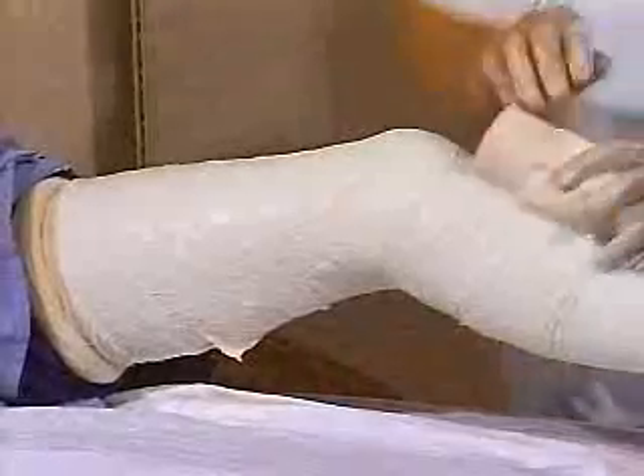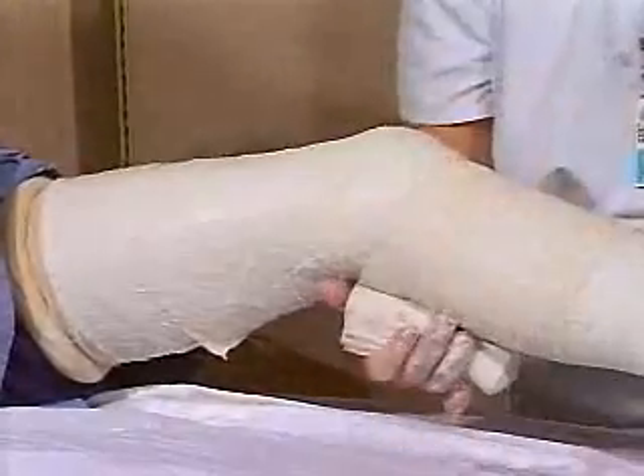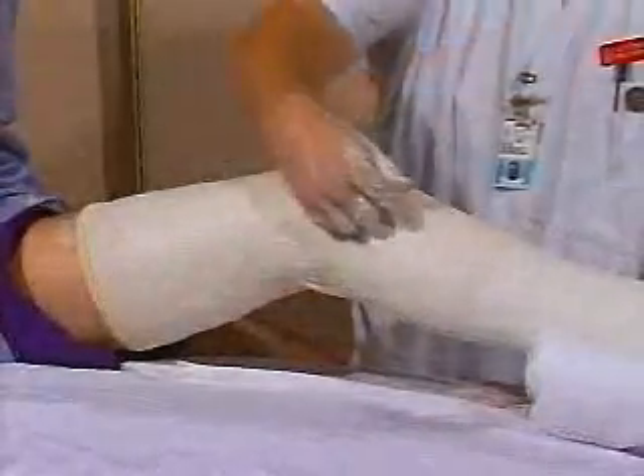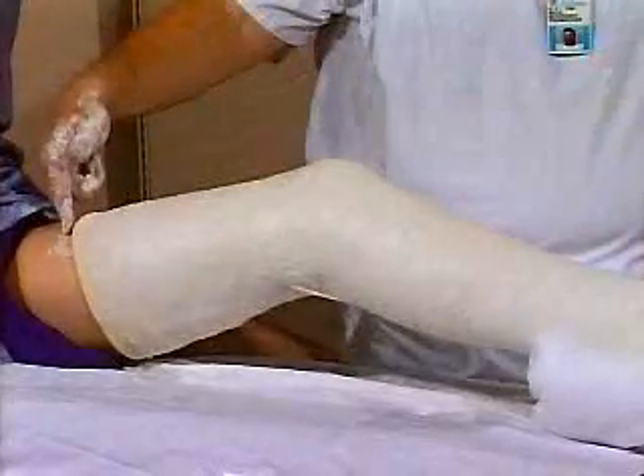Repeat with the next roll. Then fold down the padding and wrap the final roll from the thigh distally. Ensure the knee is at 20 degrees of flexion.